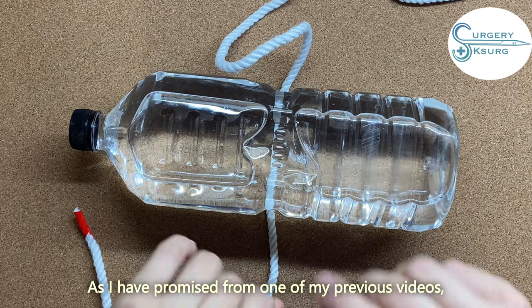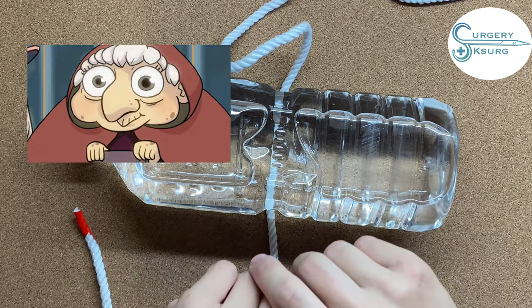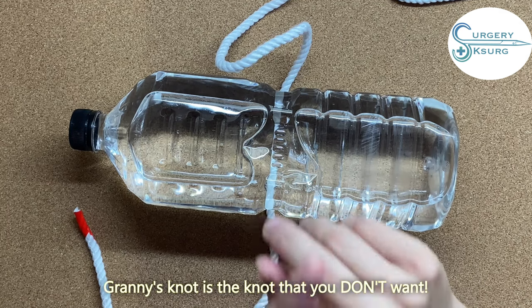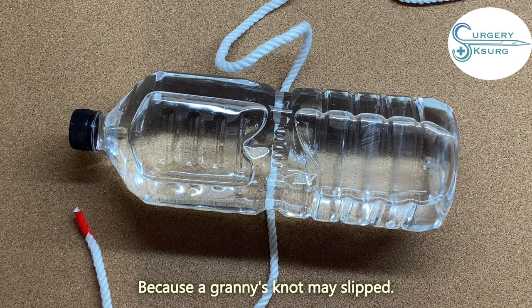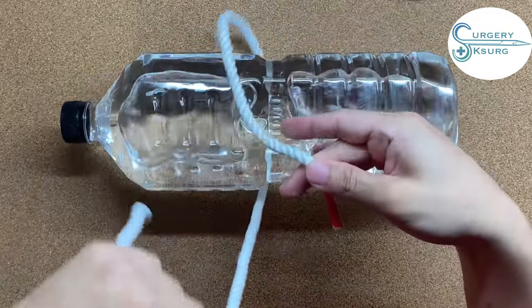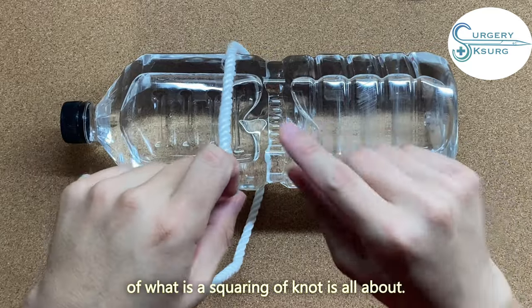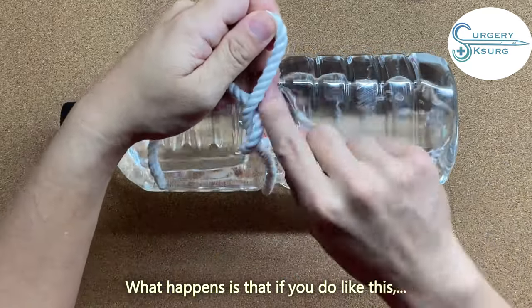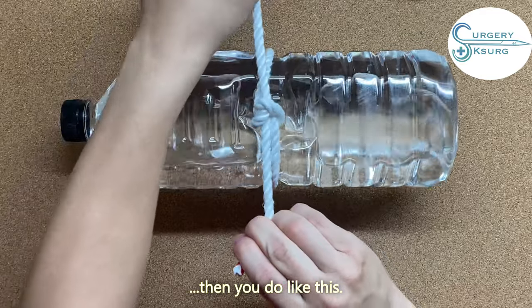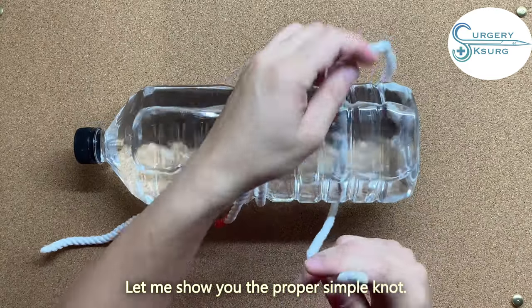I promised to show you what a granny knot is. A granny knot is not the knot that you want — it will slip. A granny knot happens when you don't square your knot, as I showed in a previous video about square knots. You do like this, and like this — you don't square your knot — and see, the knot is not square.